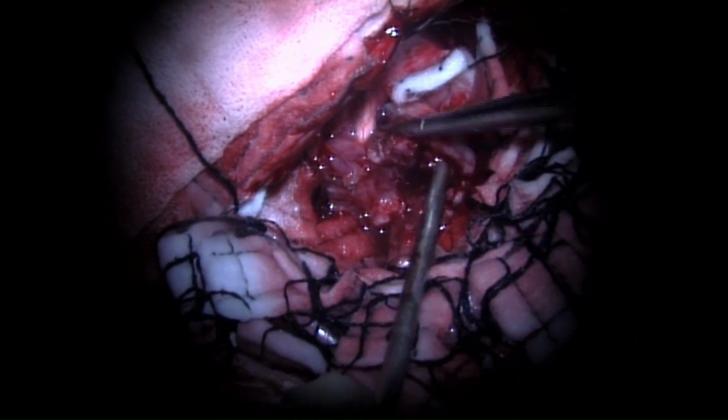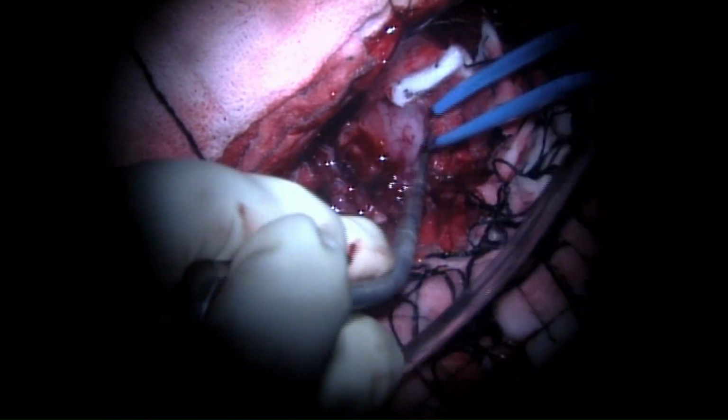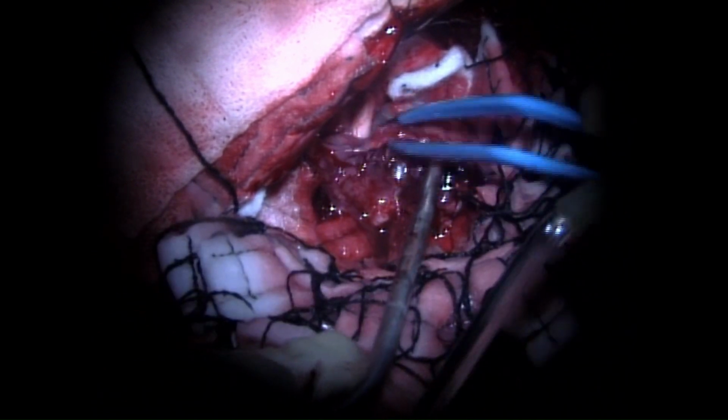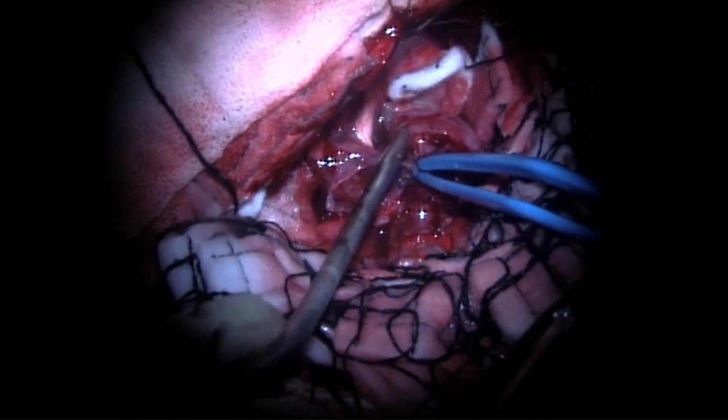Time was spent to deliver this tumor in small pieces and not damage the optic nerves or the optic chiasm as well as the thalamus posteriorly.